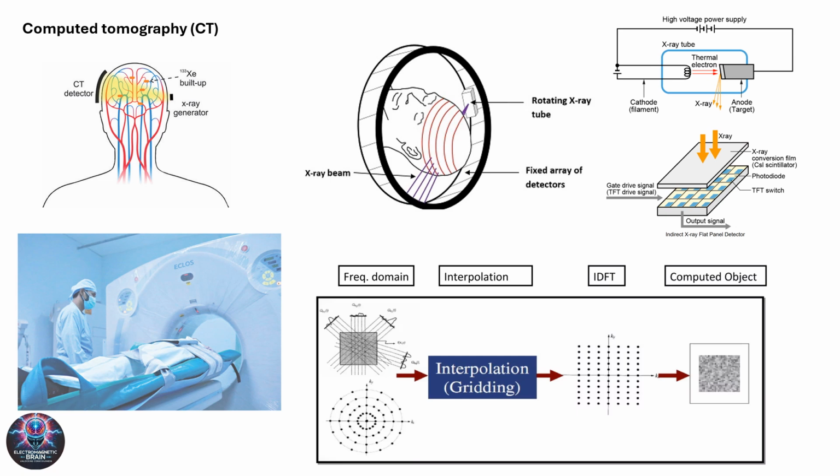Together, the images on this slide demonstrate how CT combines hardware precision, like the rotating X-ray tube, and advanced computational reconstruction to deliver brain imaging. Despite its challenges, CT remains a cornerstone in clinical diagnostics.